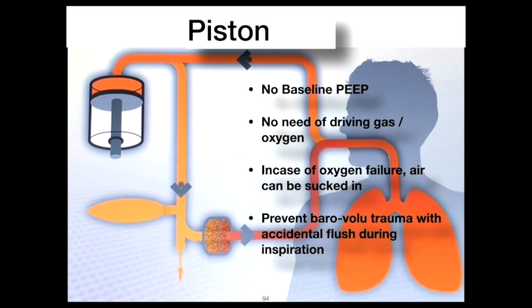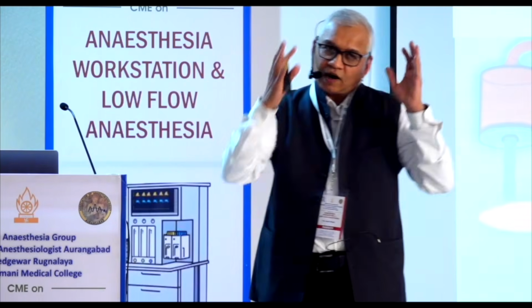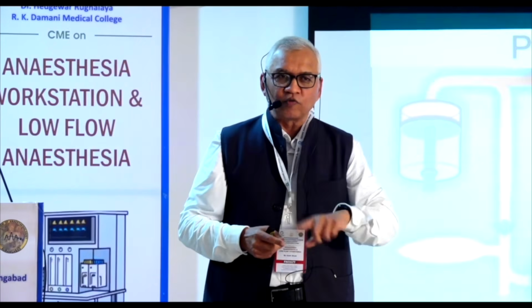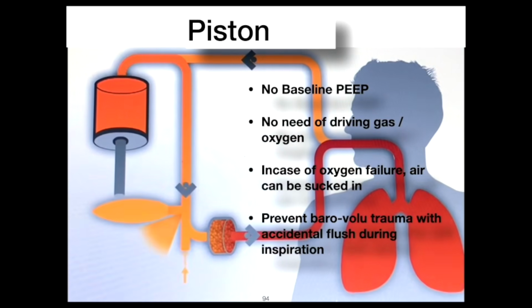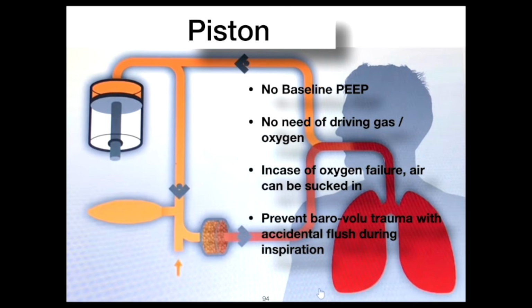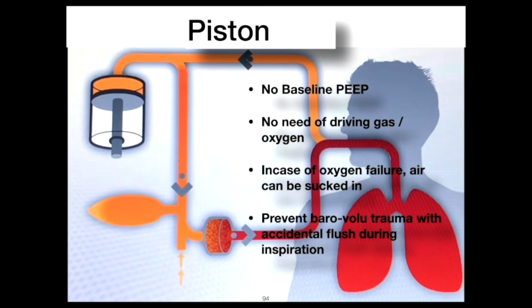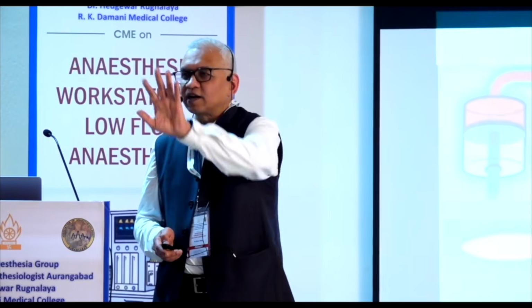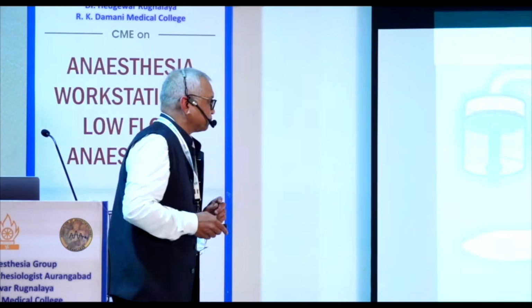Now whether it is an advantage or disadvantage, you can take it both ways. Advantage, yes, in oxygen failure you can still ventilate, but if you miss it, it will continue to ventilate air. So you have to be vigilant. There is no second thought on that. You have to be vigilant because it will continue to deliver air. Of course, it is going to give you an alarm, but we have a tendency to silence it. Right? It is very common. हम पहले silent कर देते, फिर सोचते कि क्या था. So that behavior we should change.